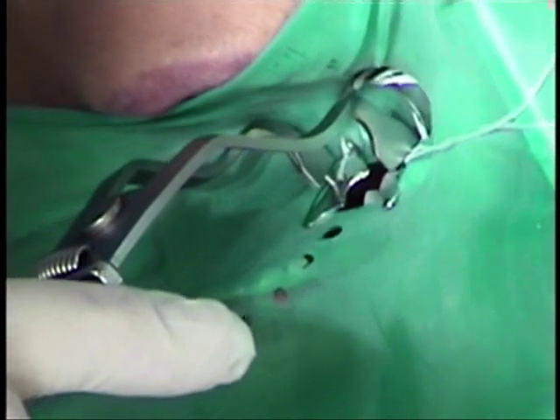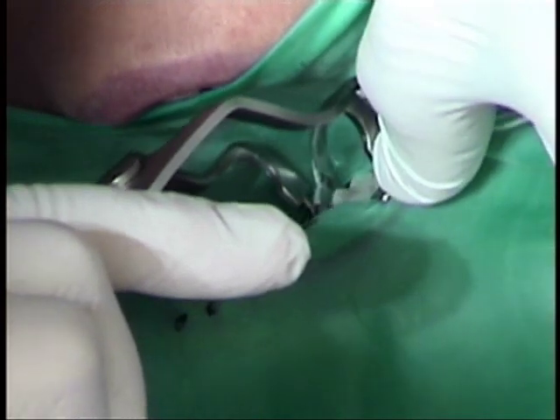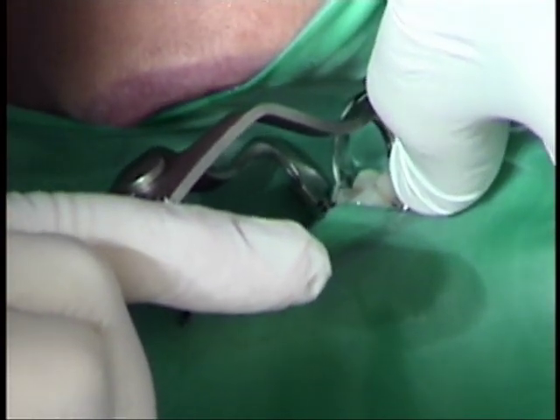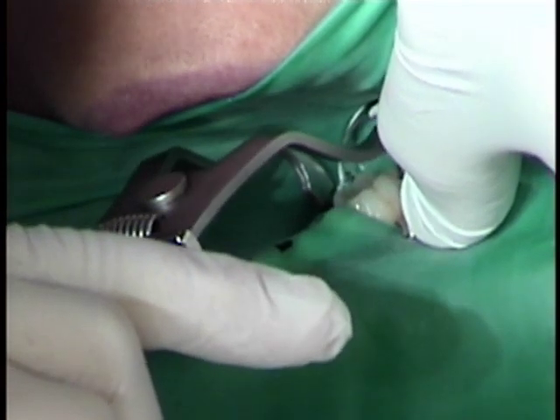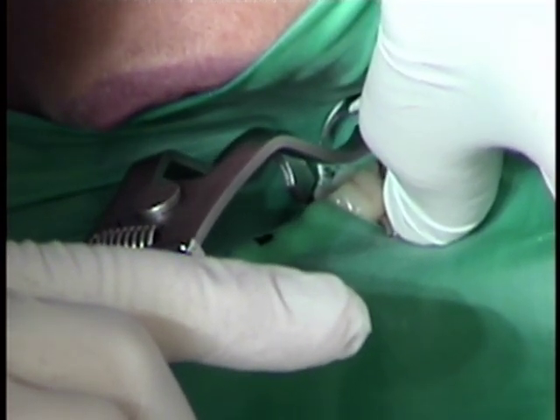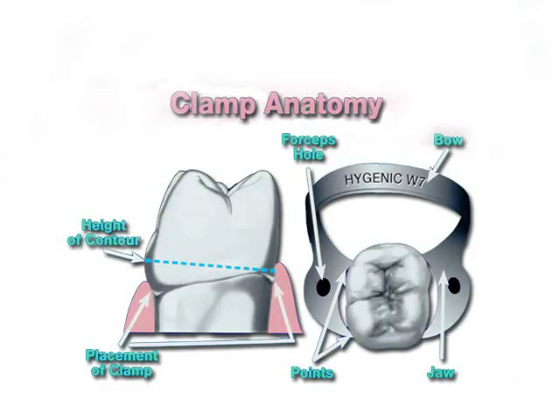When seating the clamp, place the lingual jaw first. While maintaining contact with the lingual surface, spread the clamp open just far enough to clear the height of contour. Then slide the jaw along the buccal surface and position the clamp below the height of contour. Test the seated clamp for stability with a finger.